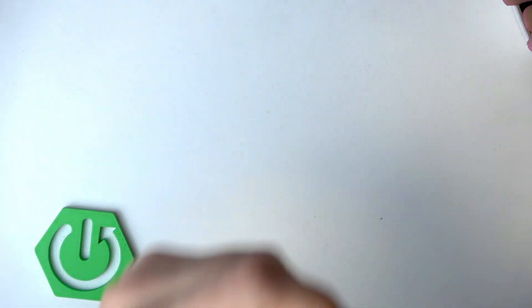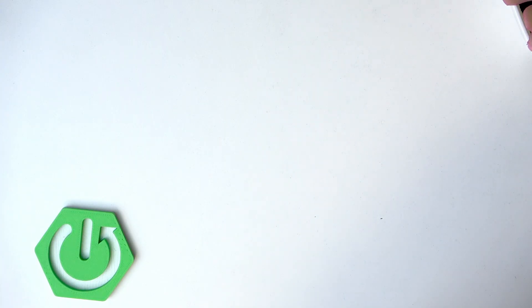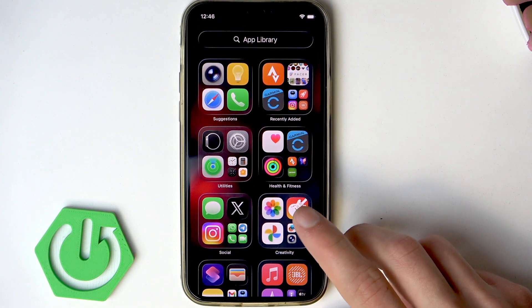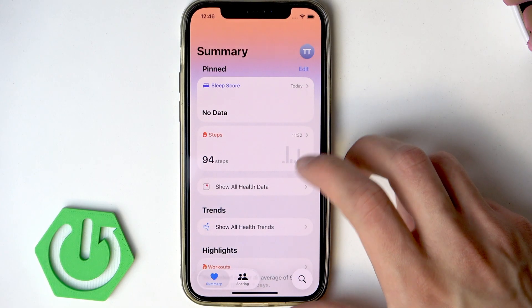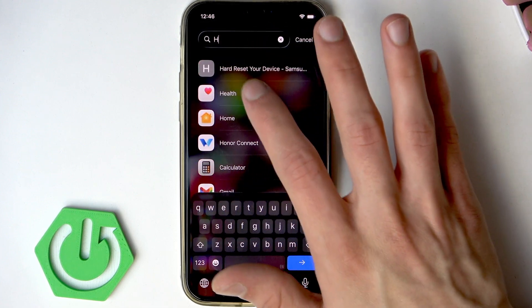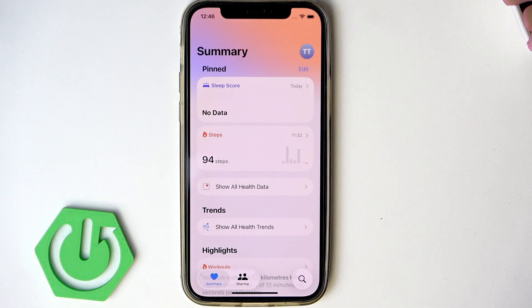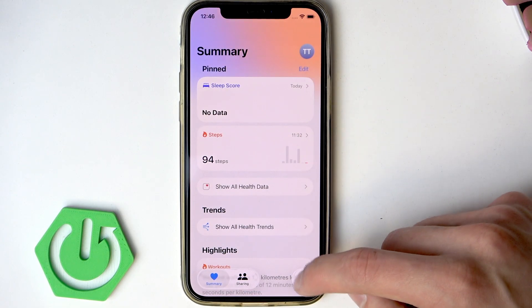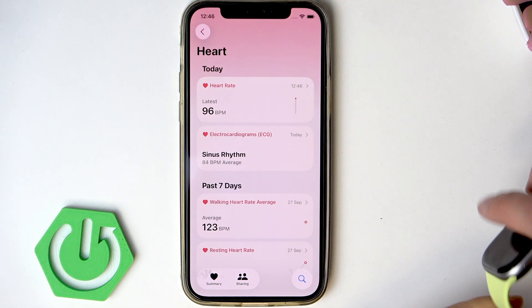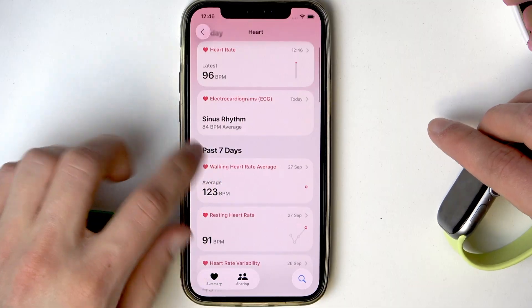To check the full results of your ECG, you have to use your iPhone. Grab your iPhone that is paired with your Apple Watch and open the Health app on it. You can find it in your app library. Then click the Browse section, go to Heart, and find Electrocardiograms.